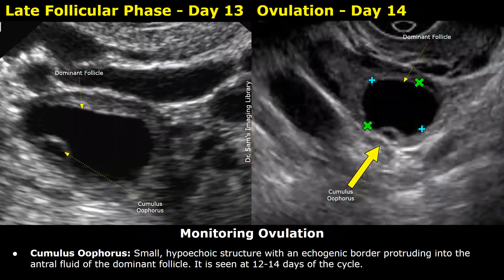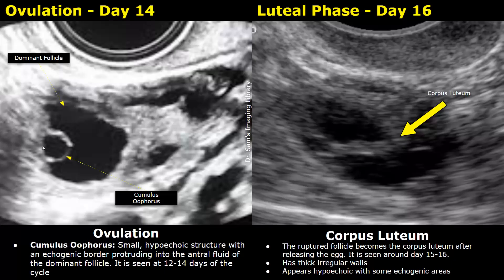These are images of day thirteen and day fourteen. Day fourteen is usually when ovulation occurs. On days twelve to fourteen, a structure known as the cumulus oophorus appears inside the dominant follicle — this is the structure that contains the egg. It appears as a small hypoechoic structure with an echogenic border protruding into the antral fluid of the dominant follicle. This is another image showing a cumulus oophorus inside the dominant follicle, seen at day fourteen.